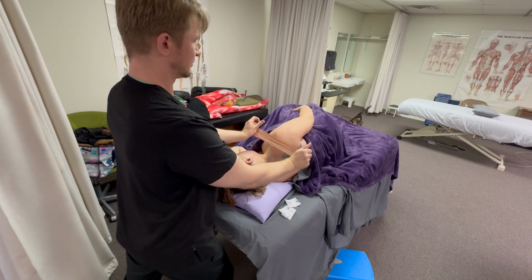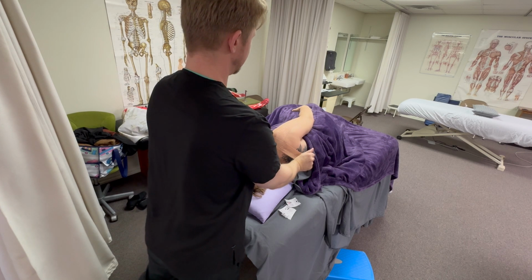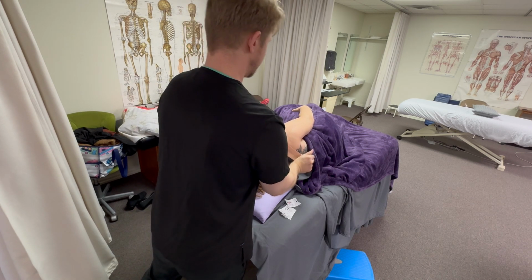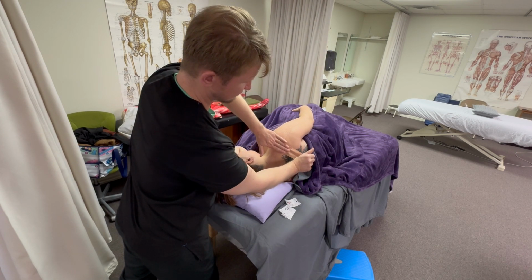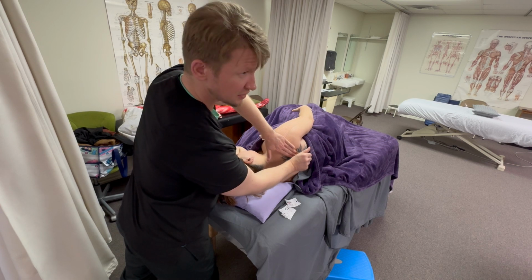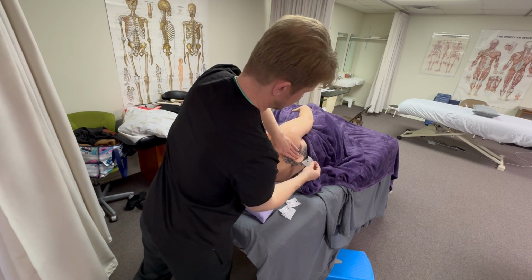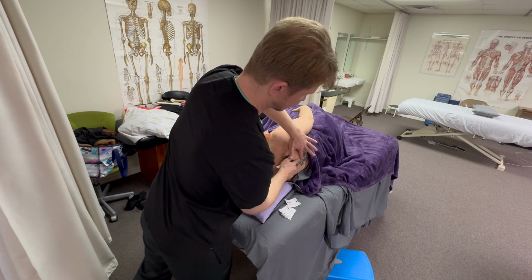Gonna go right on. And then get that to lay down. I tend to do this. I'll have this hand push the tape down. Then 0, no tension on the anchor, so nothing.